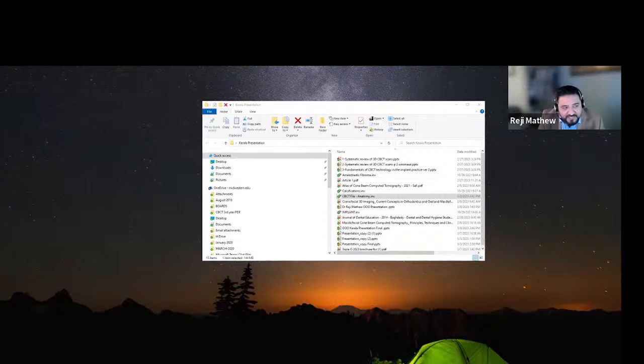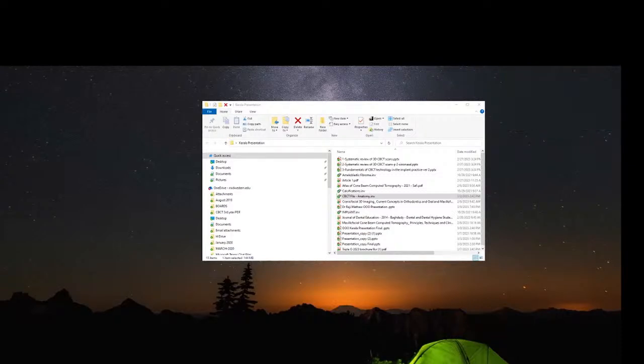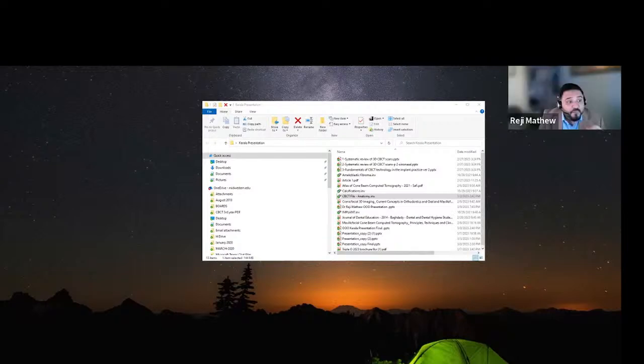For a panoramic image, and I'm saying panoramic image deliberately because that's the most common image, more than CBCTs which are taken. In a panoramic image, most people miss osteoporosis. You could look at a panoramic image and evaluate the generalized reduced bone density. You could look at the trabecular pattern. You could look at the inferior alveolar canal, which is almost washed out because of the generalized loss. And you could think that this patient might be osteoporotic, and maybe have that sent to a physician to evaluate for osteoporosis.